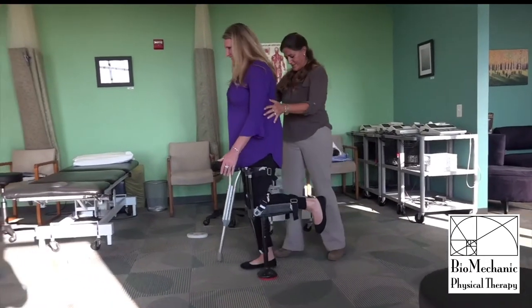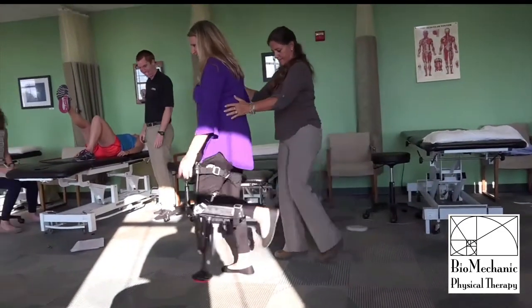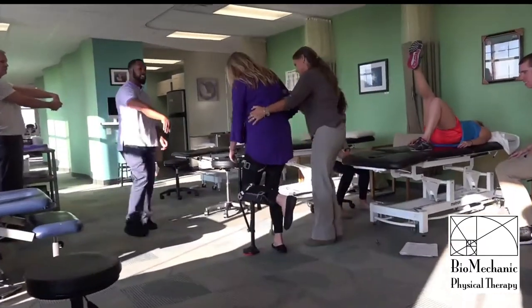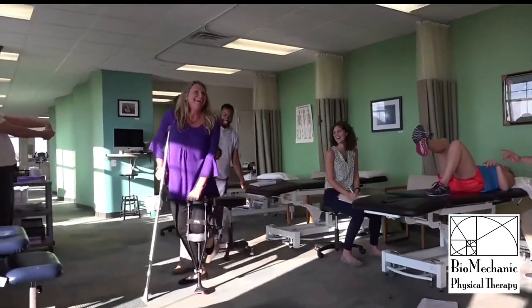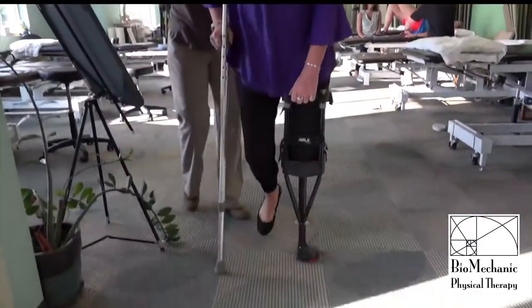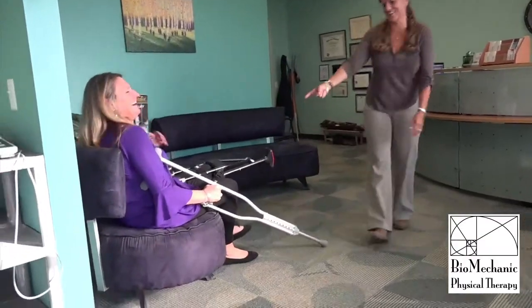This is her very first steps taking out, using a crutch and the iWalk at the same time. She's taking off pretty well. She's just discovered she can hold on to that handle on the front of the leg and give it a little bit more control.